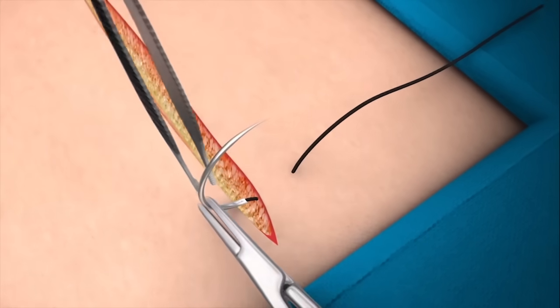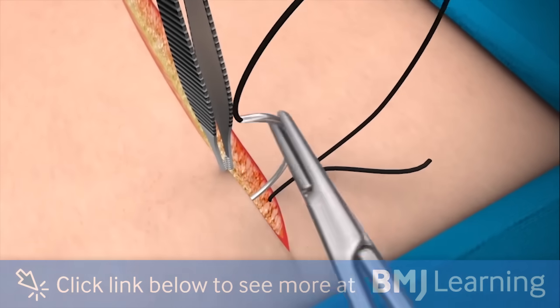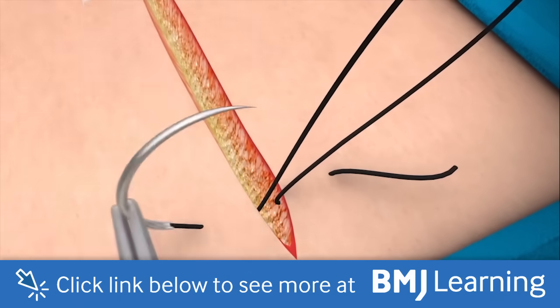Pick up the needle with the forceps and remount it on the needle holders in the correct position and pass it through the opposite wound edge, taking an equally sized bite.